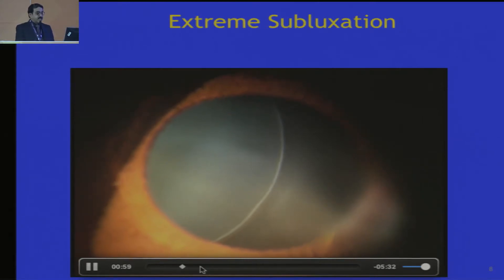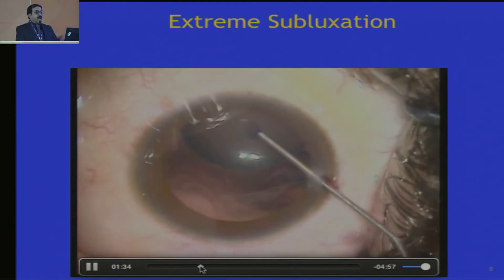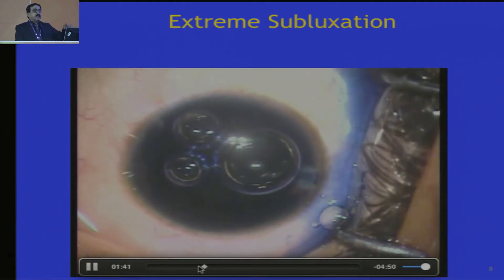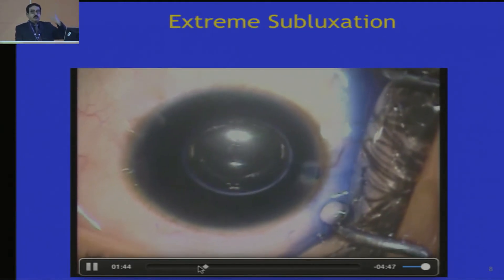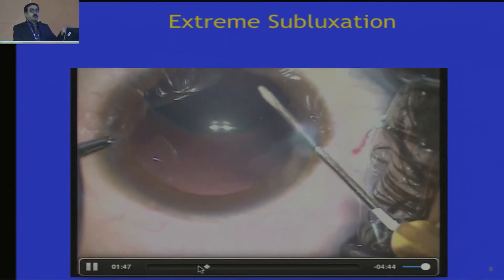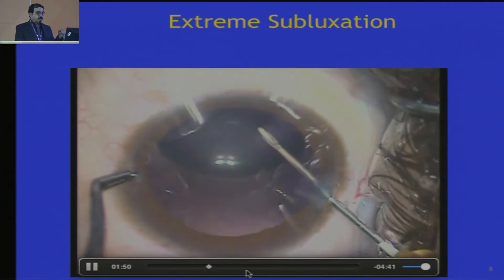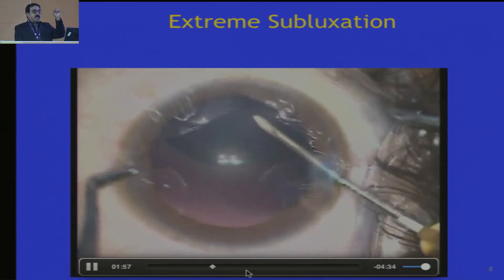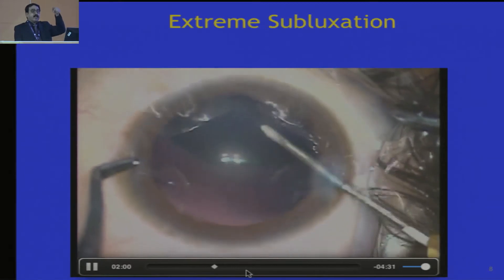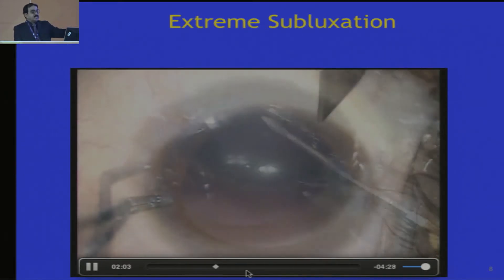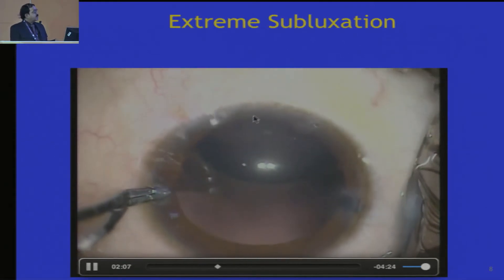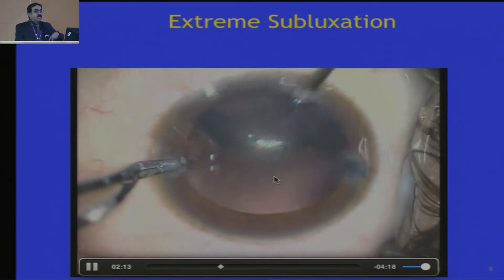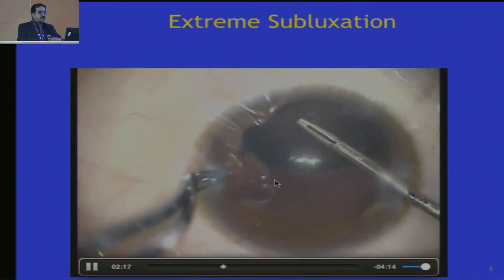The second eye of this patient, where again the subluxation was quite large — we go in and fill in high molecular viscoelastic in the area of subluxation. Thereby, when putting in trypan blue, the trypan blue does not seep into the vitreous cavity, which is very important. Otherwise you are working in a very dark night situation. Making that first nick can be tough, so you need to have either a cystotome and in some cases you might have to work with an MVR from the opposite pole. If nothing works, you might have to work with an MVR coming in so that at least you are able to make a nick. The nick is very important — difficult to make, but it can be done.